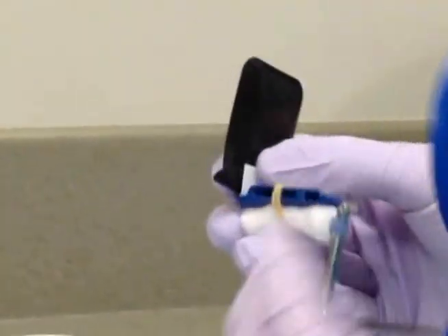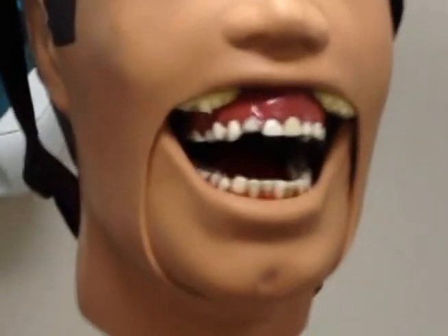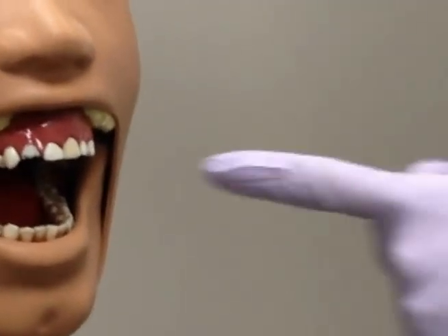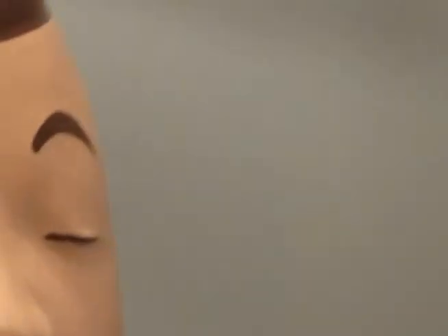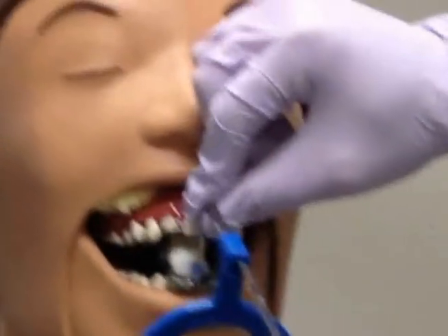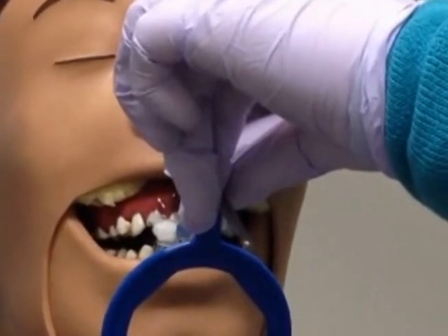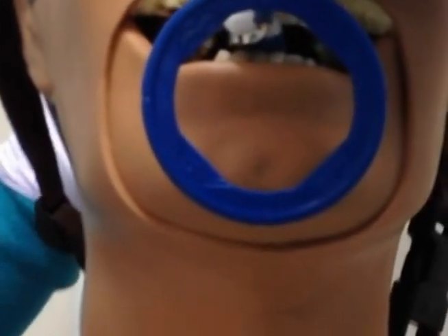Now that we have our XCP instrument and film assembled, we can proceed to take the radiograph. When positioning the XCP in the patient's mouth for a mandibular central incisor periapical, you want the end of the bite block not attached to the rod to be pointing down into the floor of the patient's mouth and the rod coming out of the patient's mouth. Make sure to center the bite block behind the patient's mandibular central incisors, resting the portion of the bite block attached to the rod on the incisal surface. Once you have the correct positioning, instruct the patient to bite down. Now slide the circle apparatus as close as possible to the patient's mouth. Next, line the X-ray unit up with the notches in the circle apparatus.